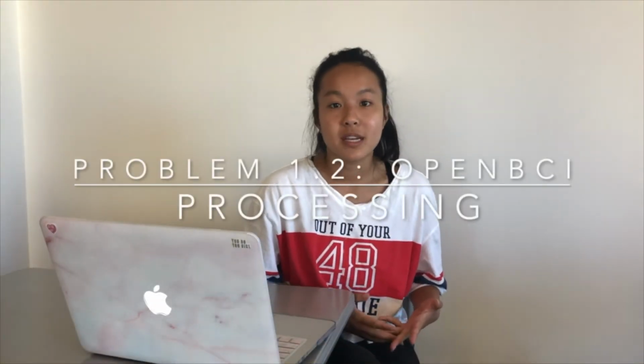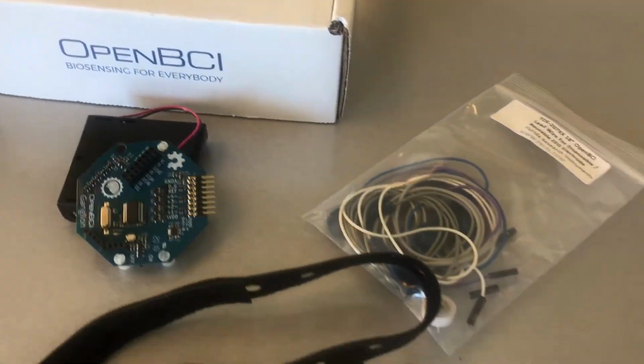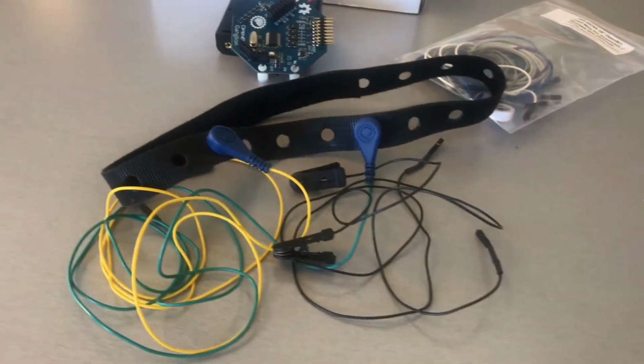While using the OpenBCI headset, we encountered several connection problems that resulted from things such as deprecated board files and outdated libraries. The first of these issues was figuring out how to program the Ganglion board via the radio module. As these board files were at the end of life, we could not download them, and as a result this led to setbacks in programming the Ganglion board.